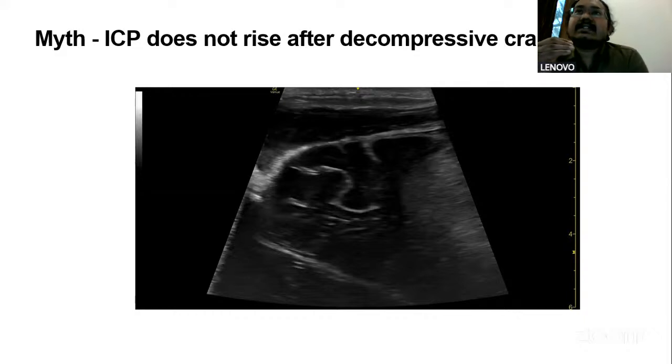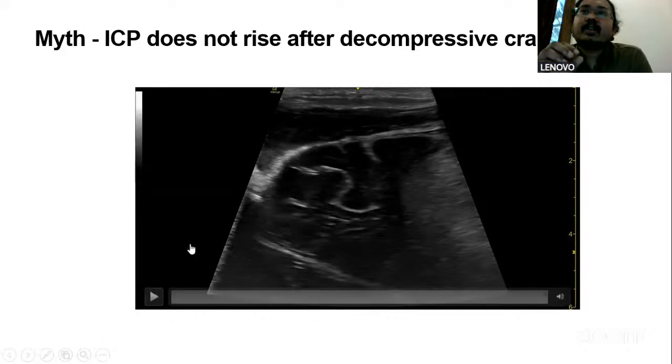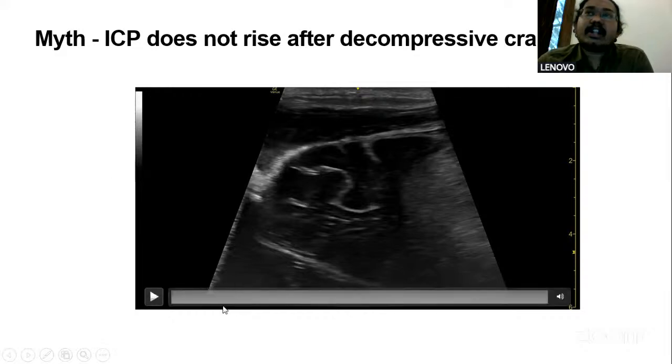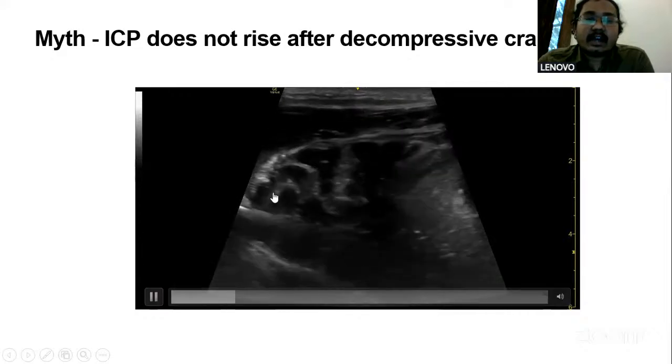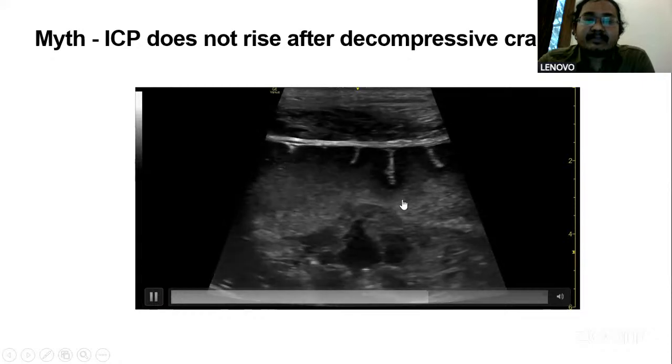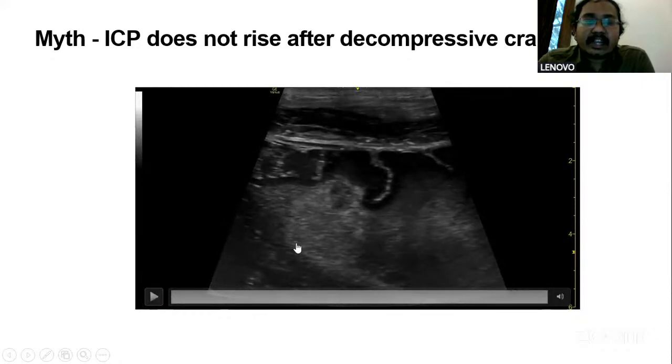But then, as critical care physicians, we have our own way to do it, and our favorite tool is ultrasound. What I have done is I've used a linear ultrasound. Now that the flap is not there, the skull is not there, I've used a linear ultrasound to see what is beneath the surface. You can see a beautiful surface of the brain with gyri and sulci, and this particular white area is the edema. I'll show it to you again.